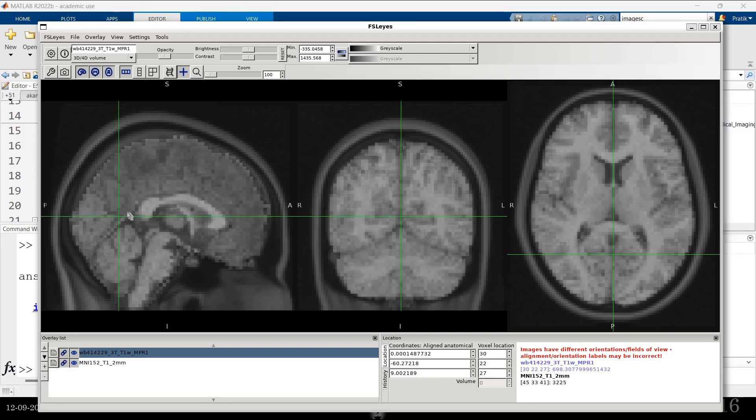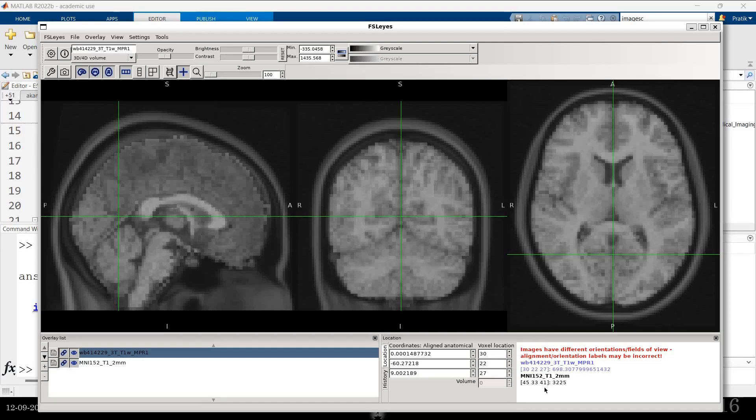When I have my cross over here, for the MNI template, the voxel coordinates is 45, 33, 41. But then for the image, it is 30, 22, 27. So these are two different images.